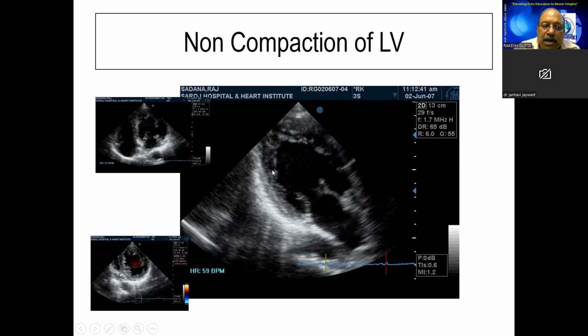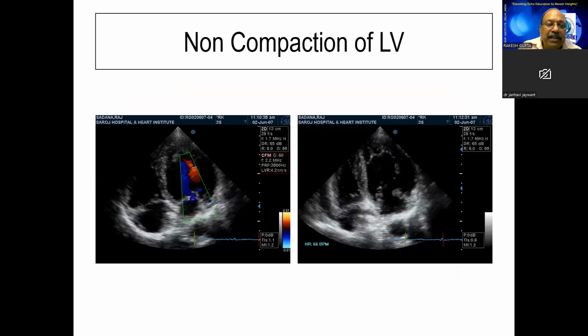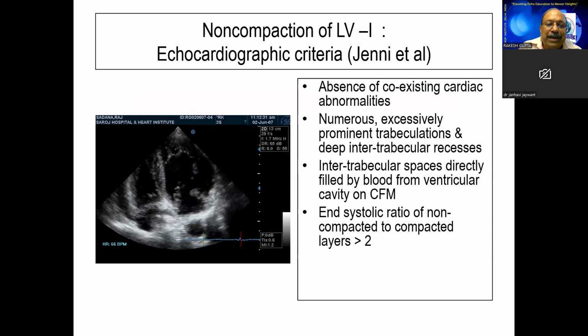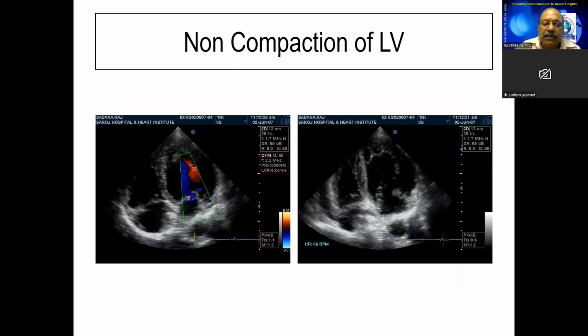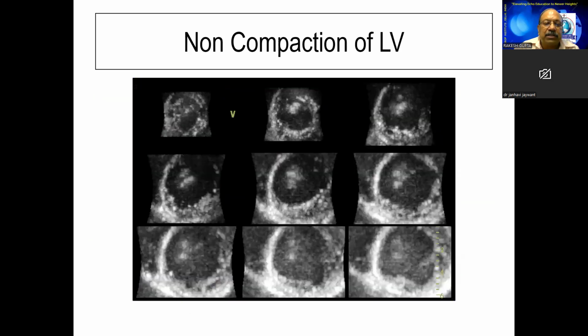The apical septum shows multiple burrowed areas, as if insects have burrowed into the endocardium. Look, multiple of them. If you switch on colors, you'll find the color getting into these burrowed endocardium. In three-dimensional structures, the apical segment shows burrowed endocardium and the basal segment shows normal endocardium.